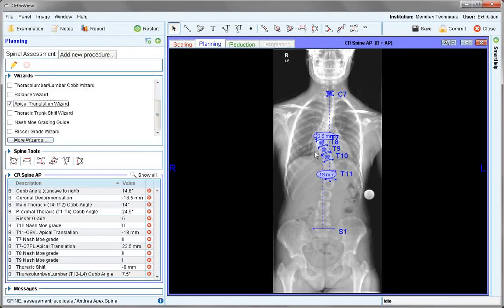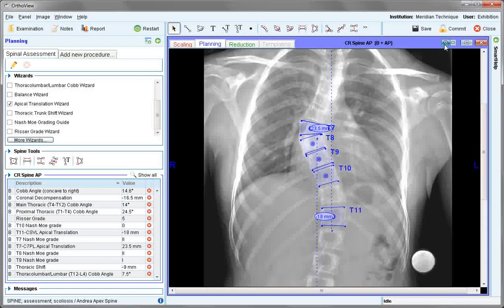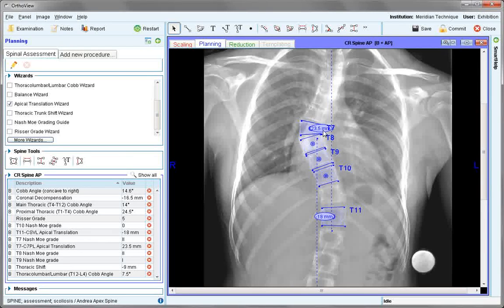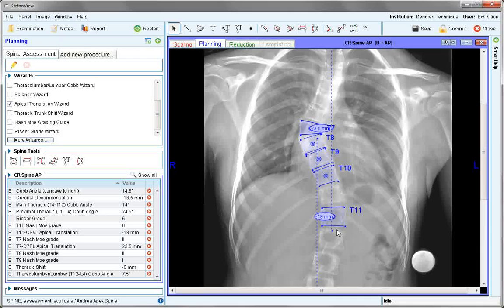Now looking at the apical translation wizard — this is the shift at the apical points of the scoliosis curve. Zooming into that area, we can see that T11 and T7 have been selected as the vertebrae of interest, coinciding with some of the other markers. Their values of translation are recorded depending on whether they are in a positive or negative situation in relation to the S1 plumb line.